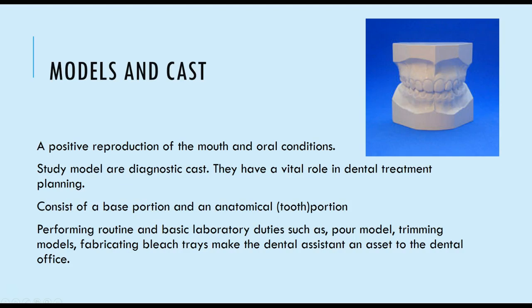We want to remember that the models in cast are a positive reproduction of the oral cavity and the oral conditions of the mouth. The study models are diagnostic, and they play a vital role in dental treatment and planning. They consist of a base portion and an anatomical portion, or the tooth portion. Performing routine laboratory duties, such as pouring, trimming models, fabricating bleach trays, and fabricating night guards, are essential to the dental office.